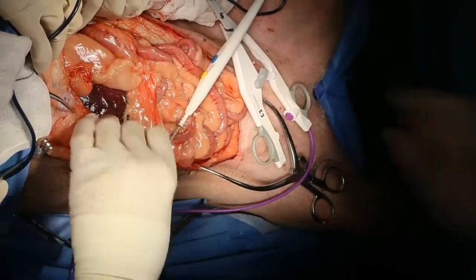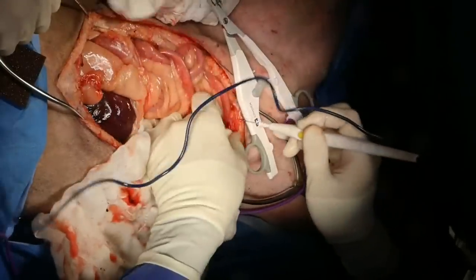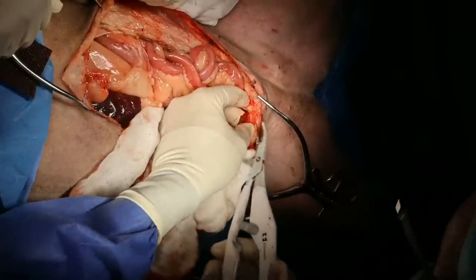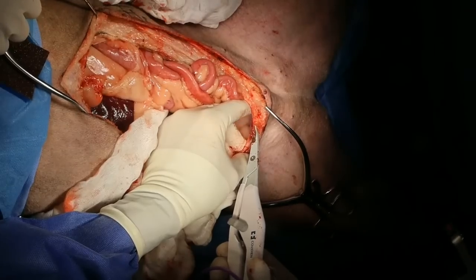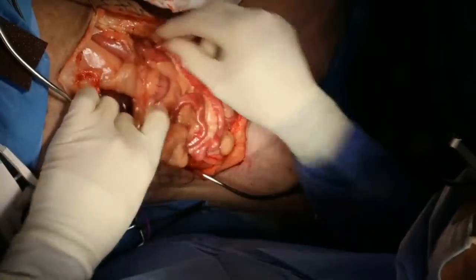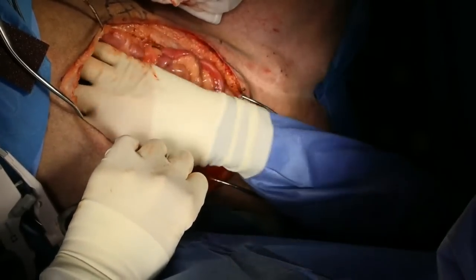Okay, so now the next question is, are we going to use a polypropylene mesh? And I guess the other thing is, would it be beneficial to do a bupivacaine or a mepivacaine block here? And I think it probably would. Can we get some mepivacaine, please? Full dose. All right, so we'll just see if it looks like this would easily close together. I'm happy to. Could do.